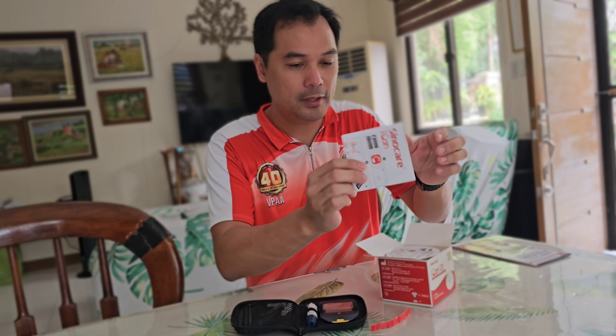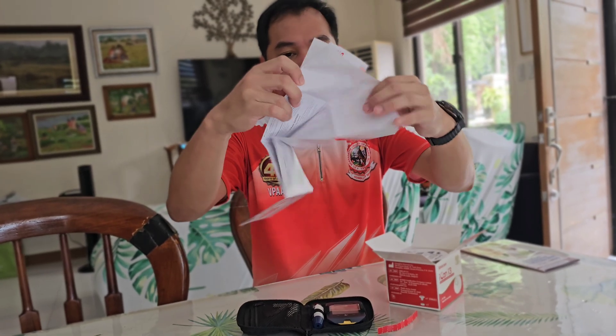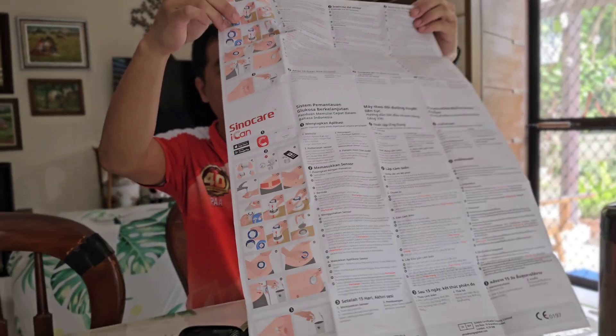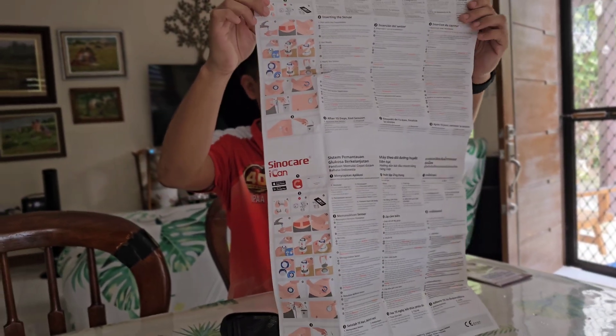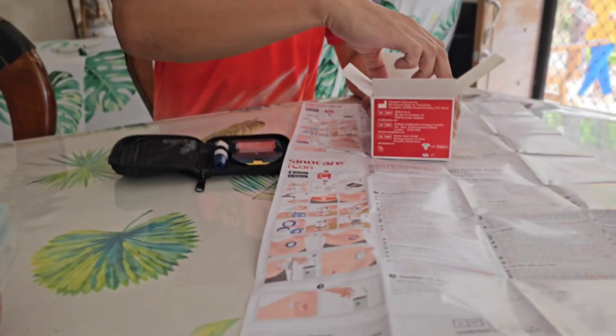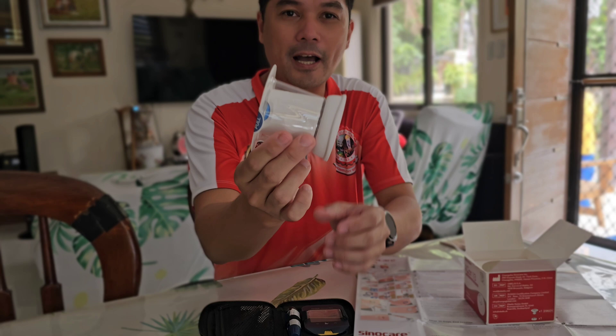Okay, it comes with this quick start guide. I think you need to download an app. We'll read this later on how to use and set it up. It also comes with the sensor — this is the sensor — and the applicator.